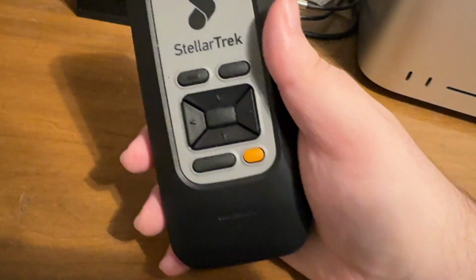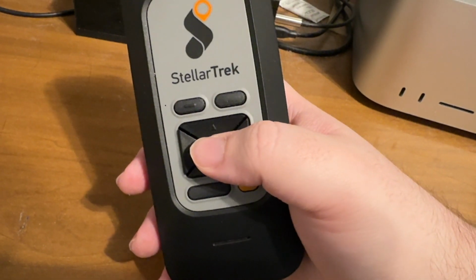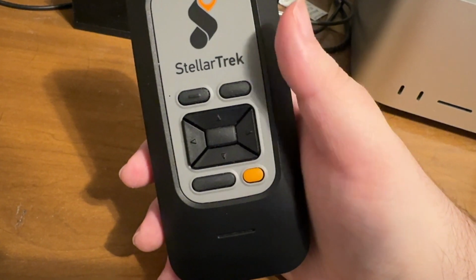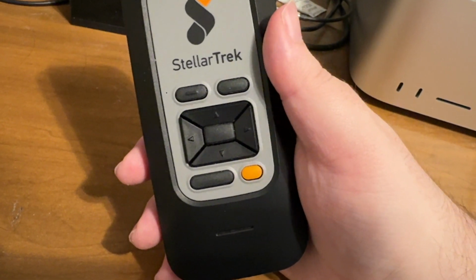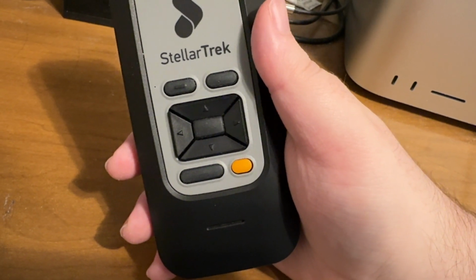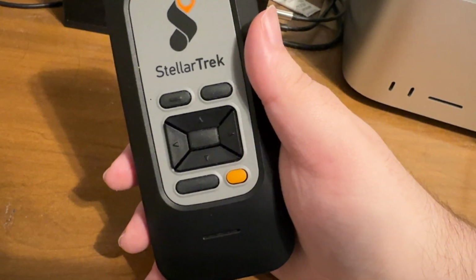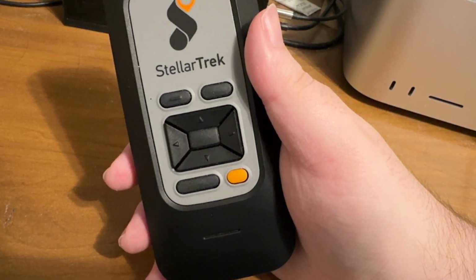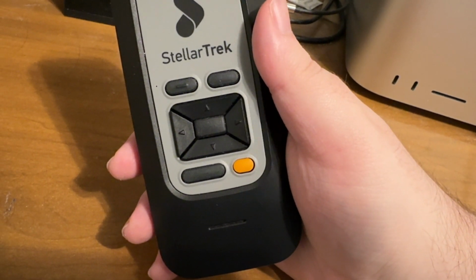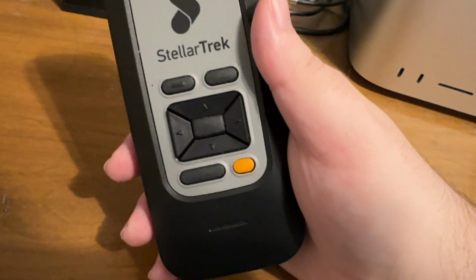Press confirm to start routing in pedestrian mode. And we can now press confirm here if we want to start a pedestrian route. So I'll do that. I'll press confirm. Pedestrian guidance, 687 Hancock Street. Route length, 0.5 miles. Remaining time, 11 minutes. Please be going to head northeast towards Warren Avenue crossing Newton Avenue with stop sign, next instruction in 282 feet. So it's going to be about an 11-minute walk, it sounds like.